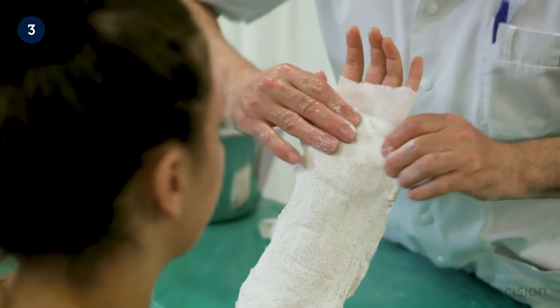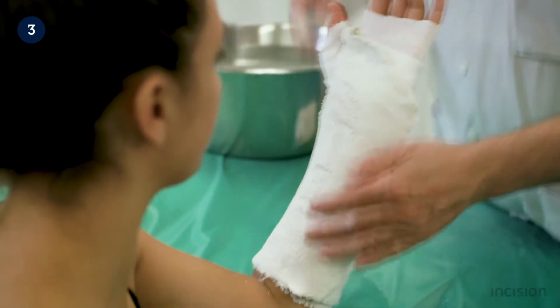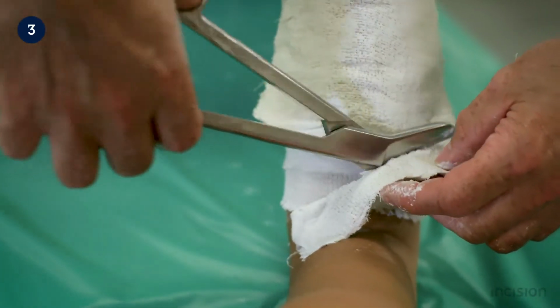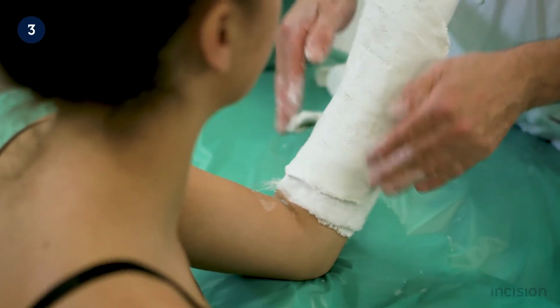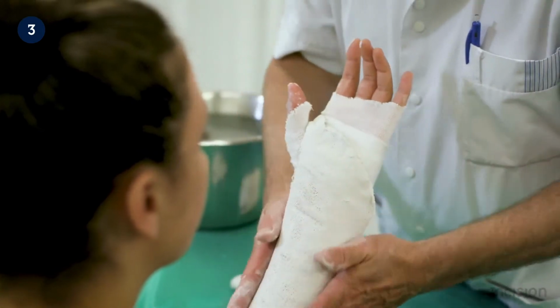It is shaped in a curved fashion so it fits well around the forearm. Note that the plaster is too long proximally. Therefore, the plaster is trimmed. Thereafter, the plaster is smoothened over the forearm to remove any wrinkles, with care taken to ensure no skin comes in contact with the plaster.